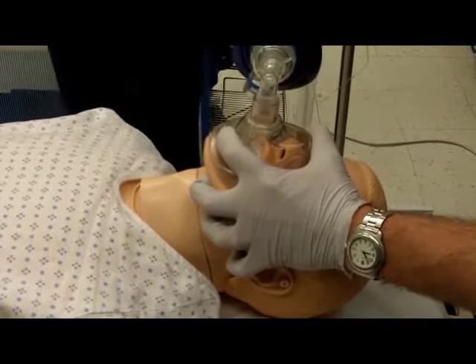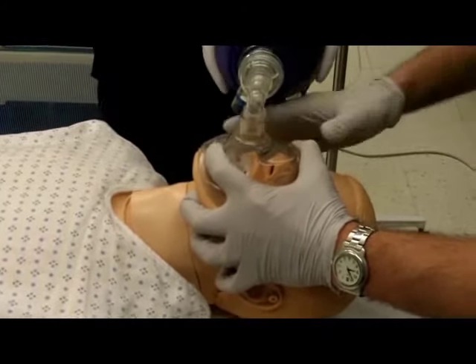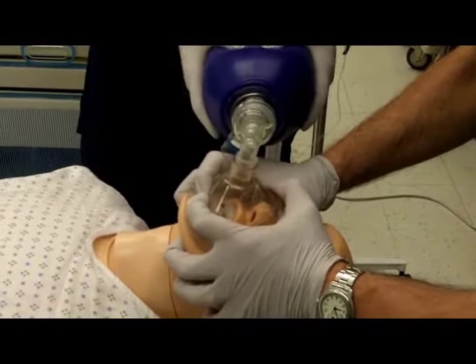If possible, use two providers with a two-handed technique over the mask. Use the thenar eminences to provide a mask seal, while the index to little fingers provide jaw lift along the mandible.